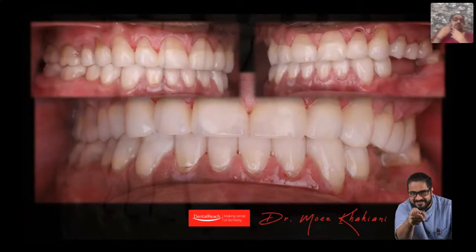Once again, look at the fact that the patient was edge to edge earlier, but we have deprogrammed and we've gotten the patient into an anterior overlap, which means anterior guidance will protect the anatomy of the posterior teeth.